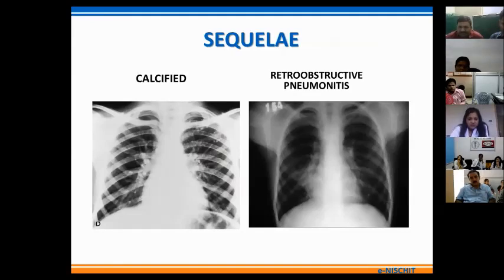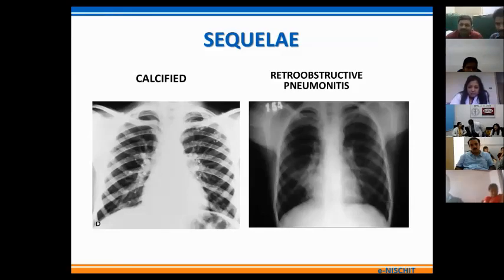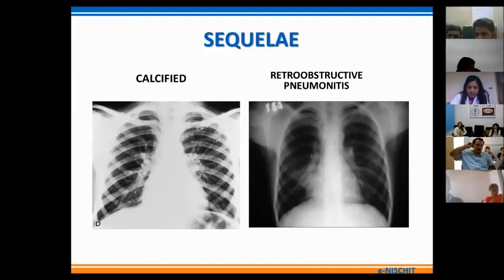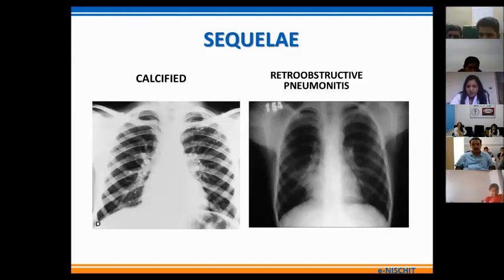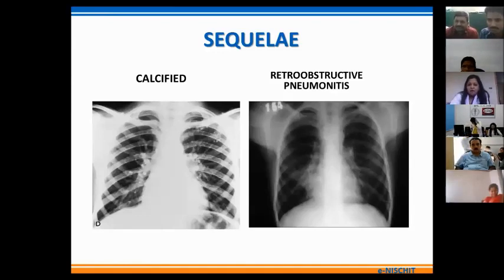In most cases primary TB is self-limiting and patients remain asymptomatic, with only calcified nodular densities in the lung parenchyma and lymph nodes as sequelae. However, in some cases complications may arise because of primary nodal enlargement, such as retro-obstructive pneumonitis due to extrinsic compression of the airways by enlarged lymph nodes. In this X-ray, widening of the paratracheal stripe represents paratracheal lymphadenopathy, and a wedge-shaped opacity abutting the cardiac silhouette on the right side represents segmental collapse or consolidation in the right paracardiac region.